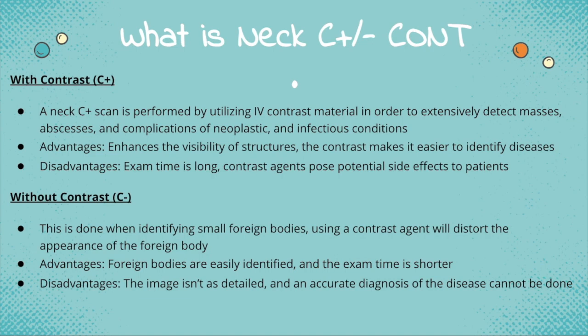The advantages of this type of scan are that the contrast material enhances the visibility of structures and it makes it easier to identify diseases. Some disadvantages are that the exam time is long and contrast agents can pose potential side effects to patients.